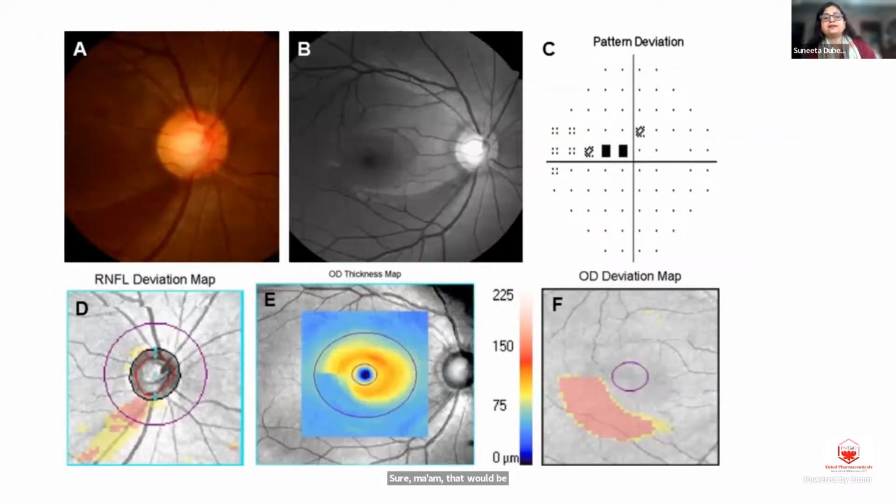As you were saying, central visual field defects are common even in glaucoma patients, in 5 to 15% of patients, and sometimes they are not recognized in 24-2. That is why nowadays we have the 24-2C test, which delineates central defects very early, and it is recommended that you also do central visual field evaluation in patients with early glaucoma. These central field defects are very commonly seen in patients who have this RNFL defect, as you can see in these black and white and colored fundus pictures, where the RNFL defect is very close to the macula. So when this happens, you will get a central visual field defect.